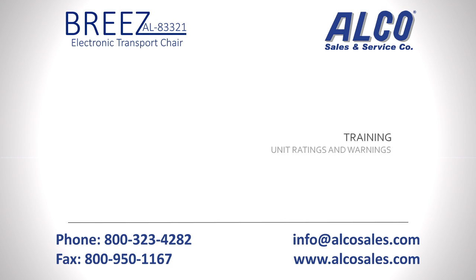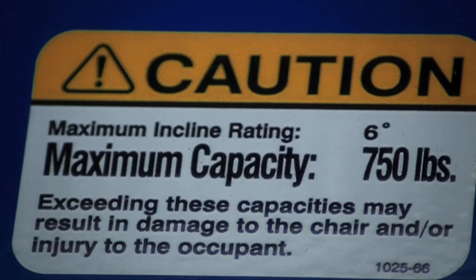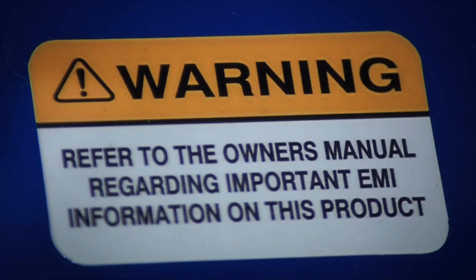The Breeze can safely transport patients up to 750 pounds on inclines up to 6 degrees. Be sure to never exceed these ratings. Before using the chair, be sure to read important warnings and cautions outlined in the owner's manual.